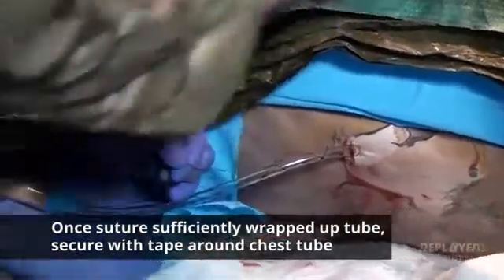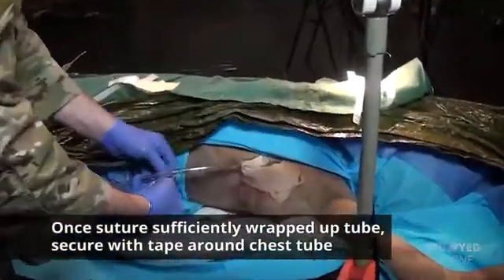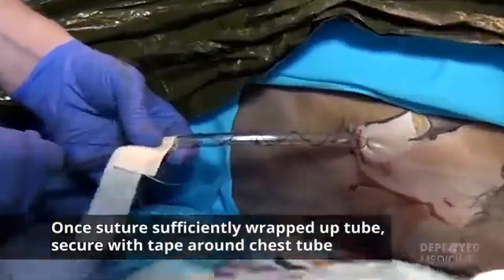Once you sufficiently have your suture wrapped up the tube, just go ahead and place a piece of tape around the tube and make sure that you close in and secure the suture within that tape.